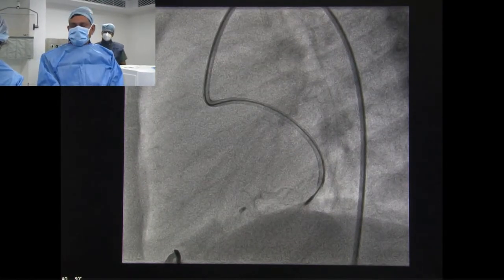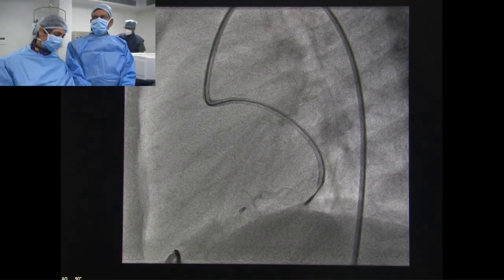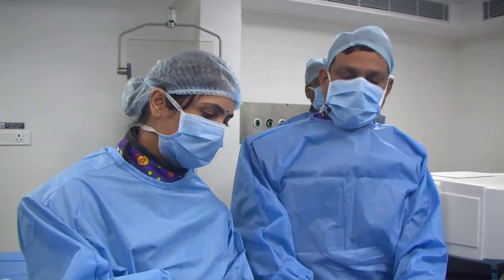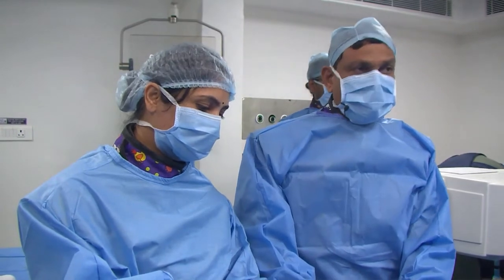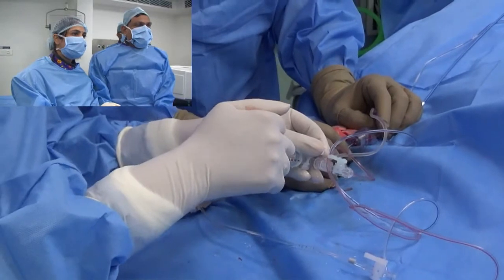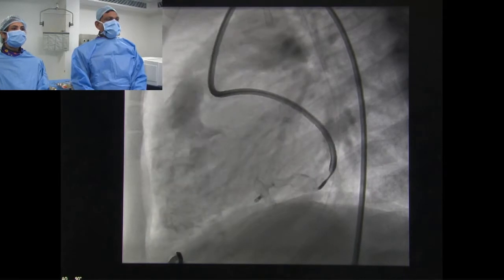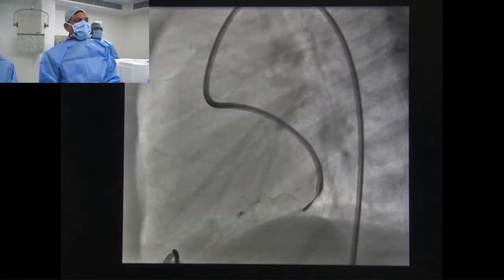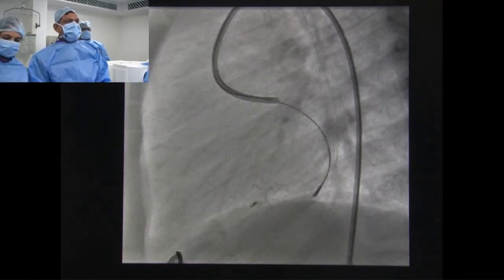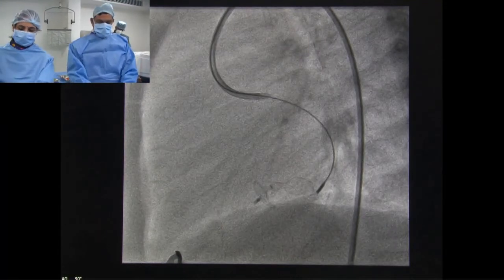What I mean to say, to avoid that small branch, is it possible with AVP2 is the question. AVP4, I agree with KK, but I did not consider that because of the low profile. But it is possible, you can position it also, I am not disagreeing with that. Angio. So that is the issue. I will pull the catheter more and then see how the left system, entire system is failing. Nageshwar, I don't think you should do anything more. I think you should. Yeah, one angio I am doing here, the last angio.